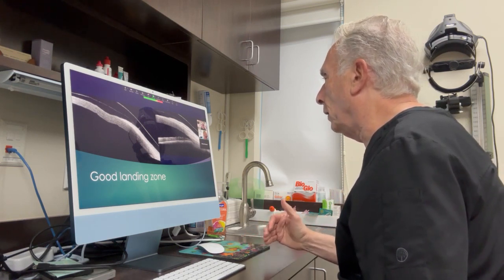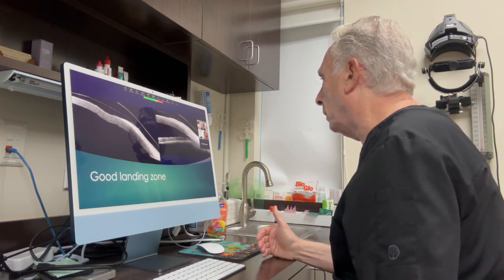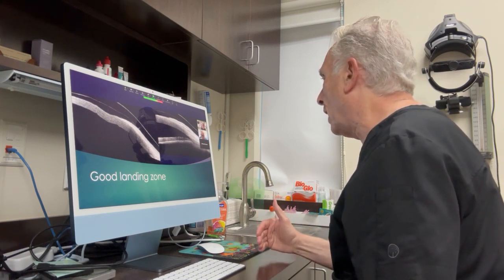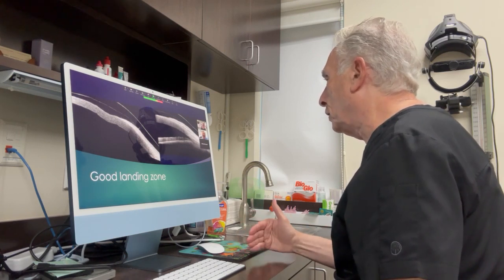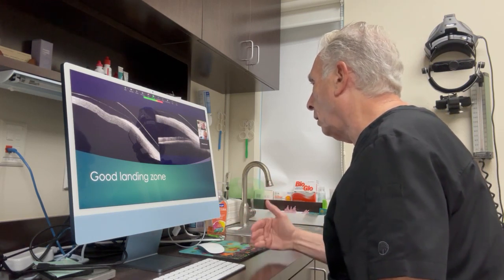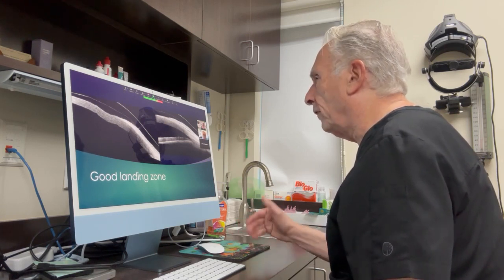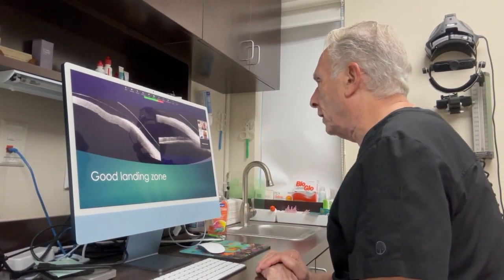If I was fitting a scleral lens, I want to vault over that part of the cornea. And sometimes you can only get by with maybe 50 or 80 microns of clearance, but you want to clear that area. After it settles down, try to have less, 80 to 100 microns. And then at 12 o'clock in the upper portion, you may have 300 or 400 microns of clearance. Then below, you have 80 microns. Just do the best you can. But there's a very fine laboratory in the Netherlands that can work with a lot of the doctors on that. I think it's Visser Lens.